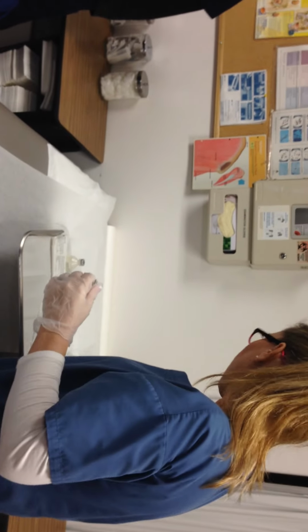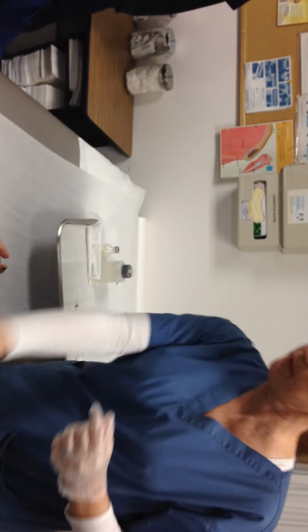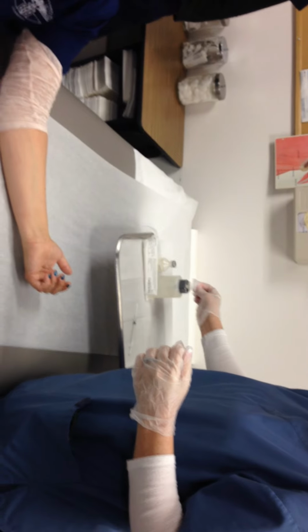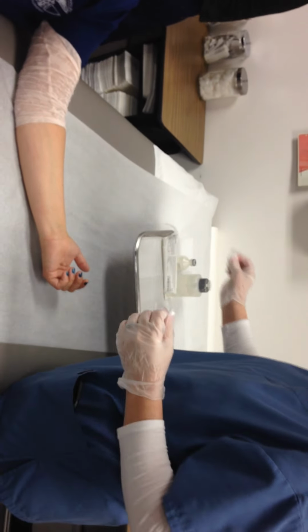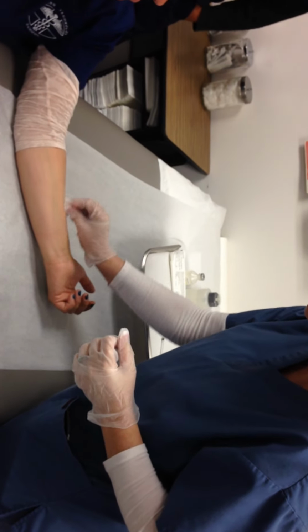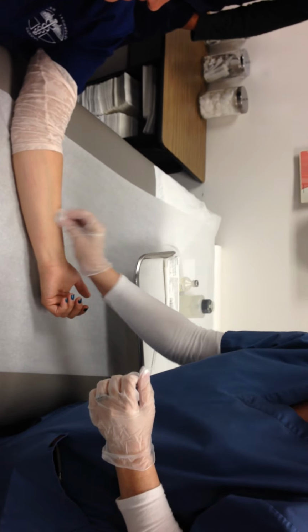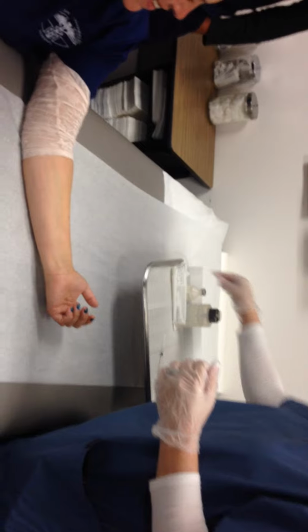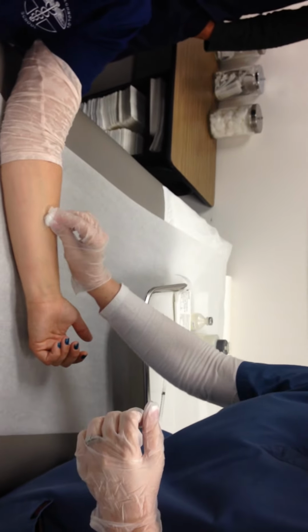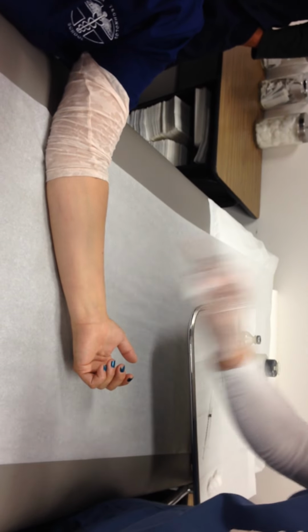Okay, so here I am. My tray and all my equipment is over here to my right, right? You see I'm not reaching over here getting my stuff. It's just right here. So I'm going to clean this area, and I already measured. And we don't want to get it soaked. Okay, right in the center. Work your way out like a snail shell. See how I did that? We don't go like this. Okay, we don't go like this. Okay, no. We go from the center. Work your way out like a snail shell. You see it? It even creates a little circle like that.